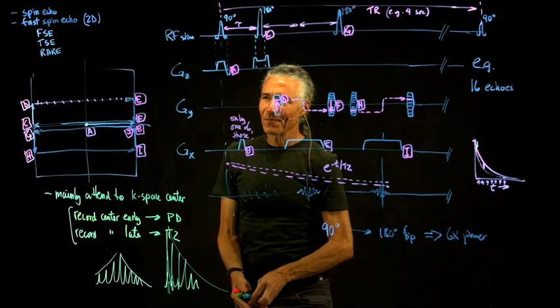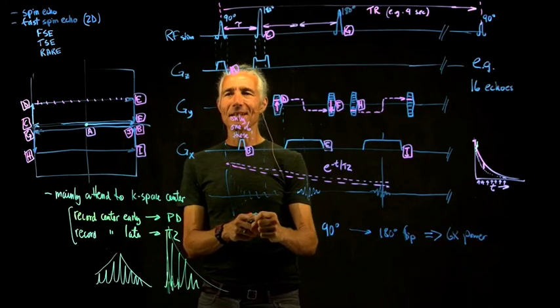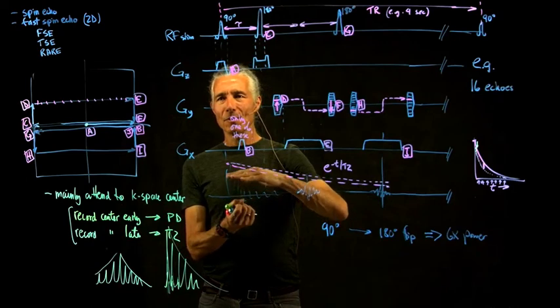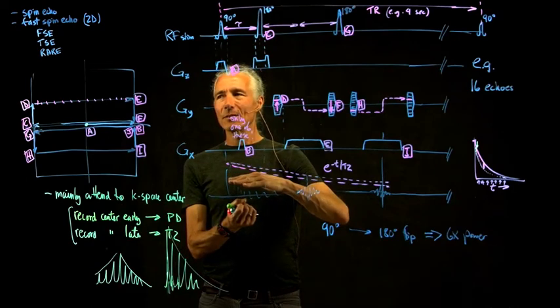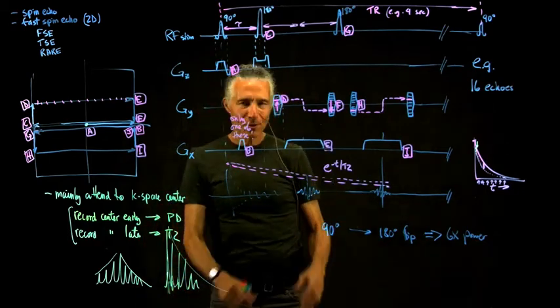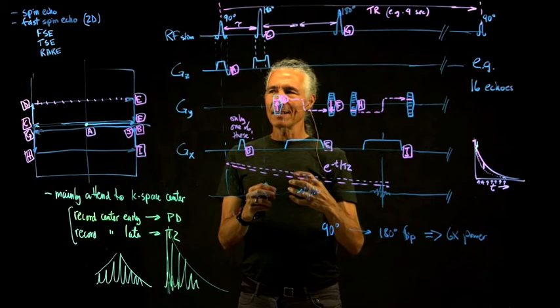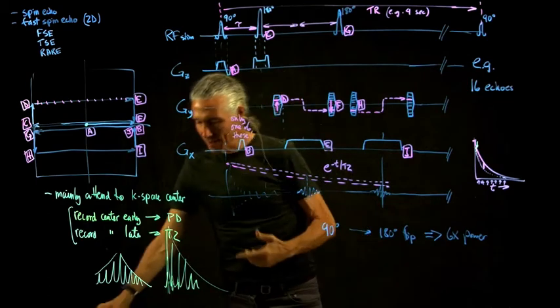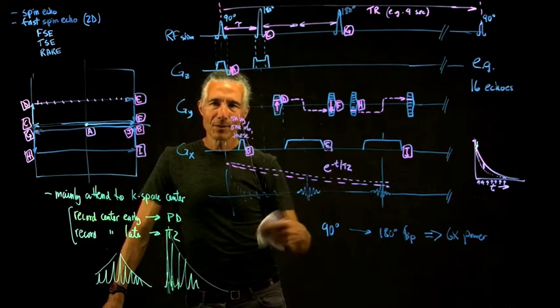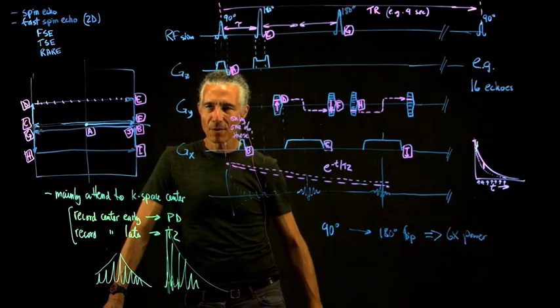One advantage of thicker slices is it blurs all those out, and so you just see, oh, that is a bad thing. That's a sizable tumor that I can see even though I blurred it through the thickness of a 4 or 6 millimeter slice. You can think of thick slices as a conceptual filter that will filter out these small irrelevant parts of the scan and just show you stuff that sticks out from normal. So even to this day, people still look at these relatively thick slices for that reason, because it blurs out some of the irrelevant noise in the image and shows you something that's worth following up on.